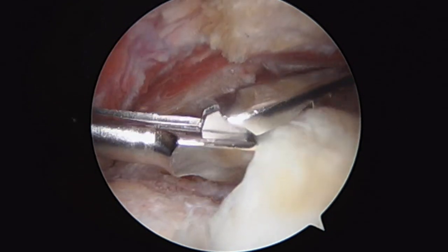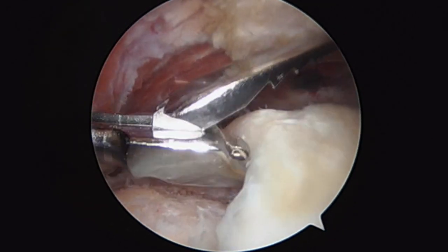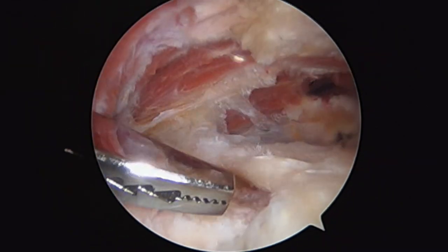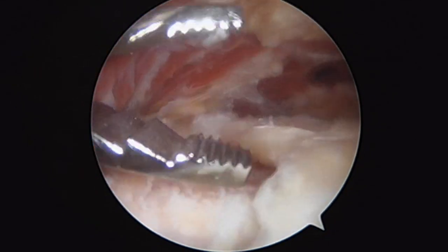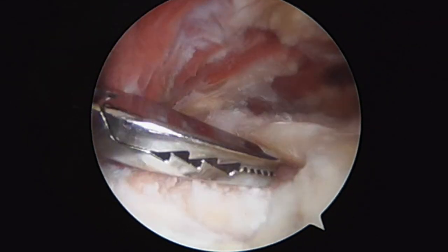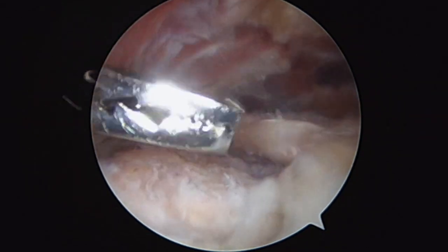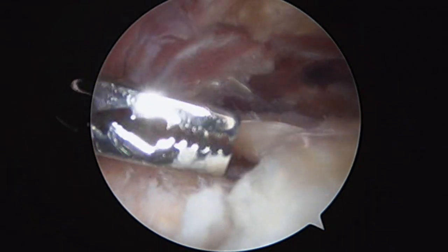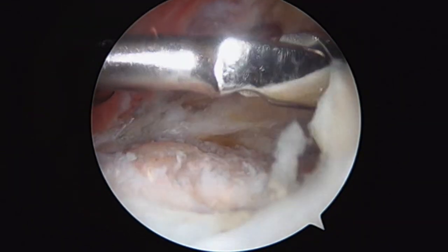This is the rotator cuff tissue here. Just to address something that's a little bit of a misconception in the shoulder — some patients say they have a rotator cuff tear and they went to therapy and they did injections, but it's physically impossible to fix a rotator cuff tear without surgery. And that's a full thickness rotator cuff tear because the tendon starts to retract. Here's the supraspinatus tendon, and as you can see, it's ripped off the bone.